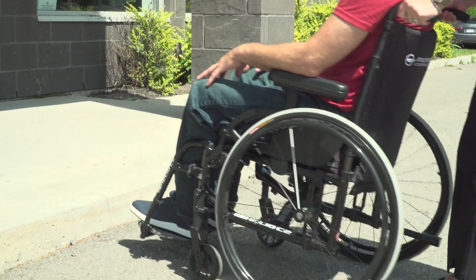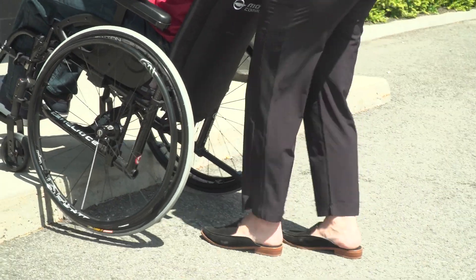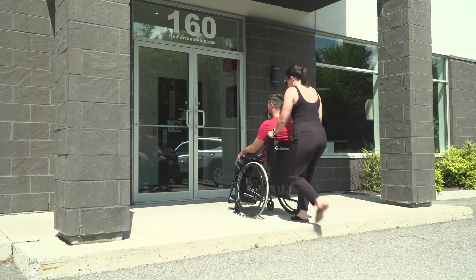If you're assisting with push handles, approach the curb and then use the anti-tip bar to get the casters over the curb, and then lift the rear wheels.